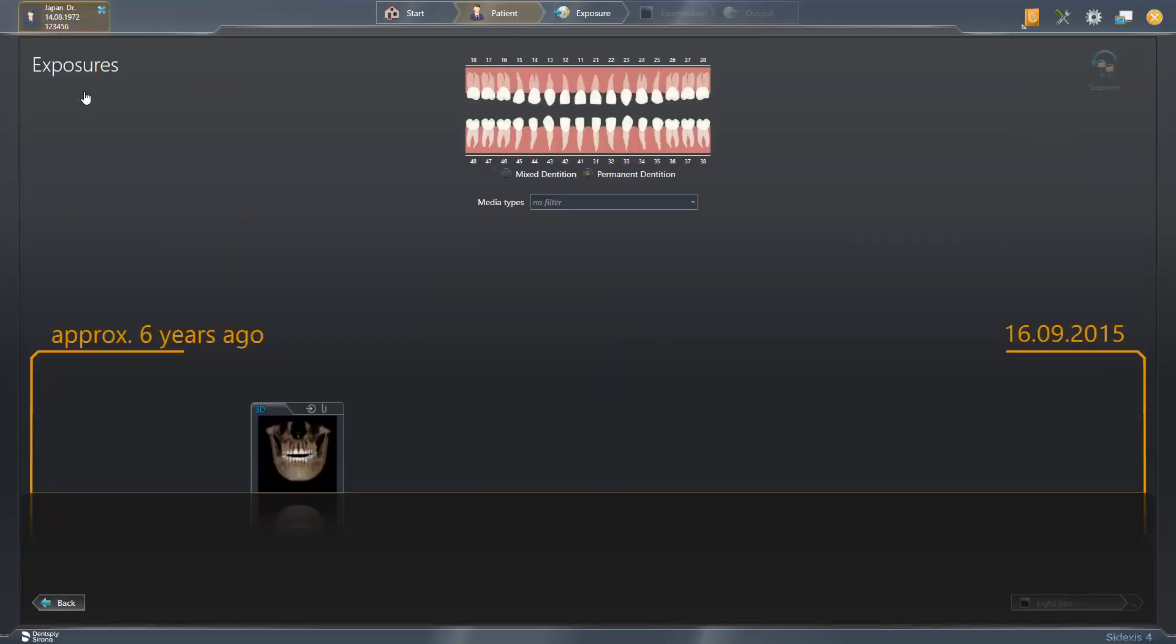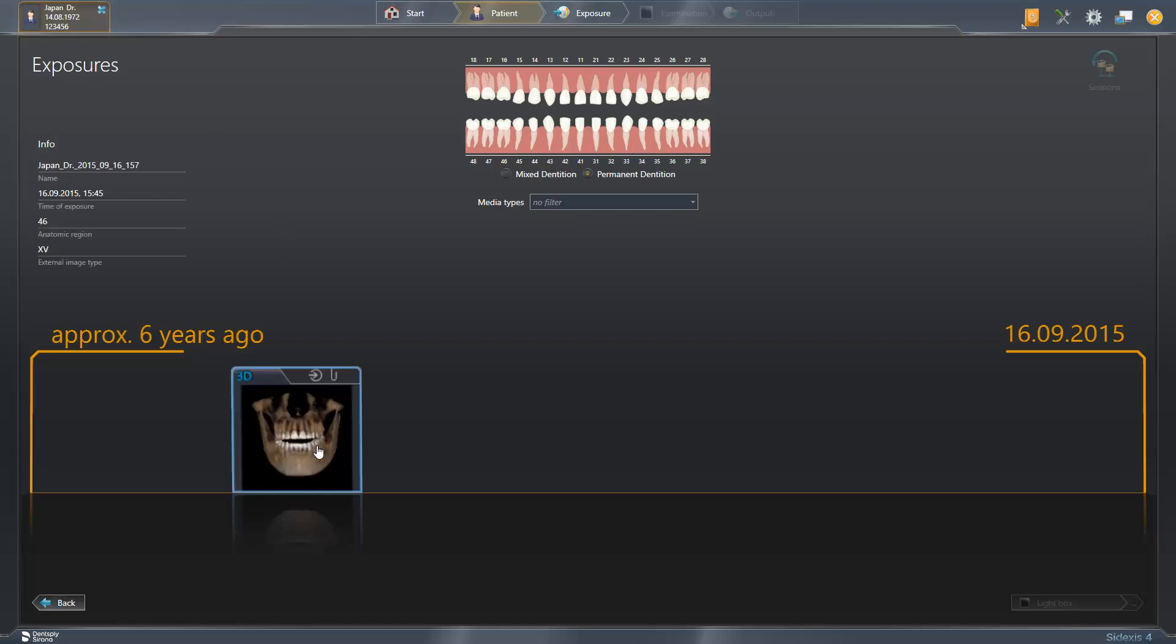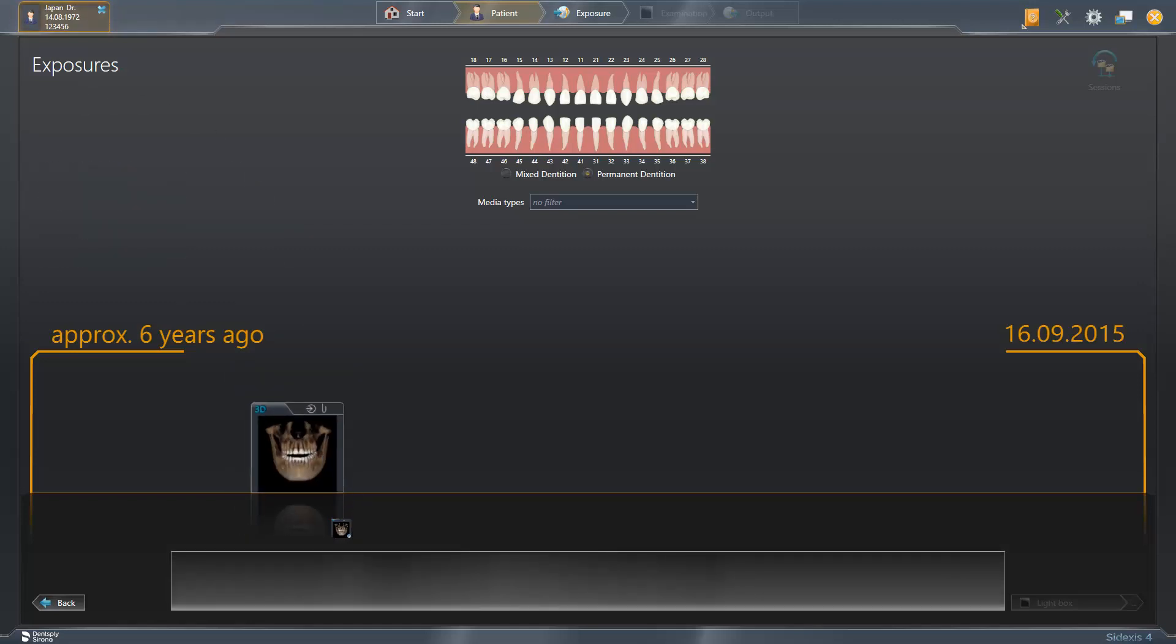A timeline is displayed that can be scrolled through with the mouse if necessary. Here, all the patient's exposures have been stored in chronological order. We select the corresponding data set and drag it, with the left mouse button pressed, to the clipboard.